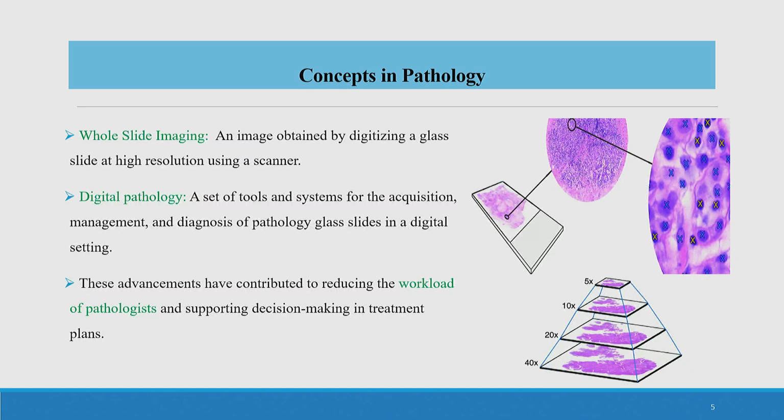Previously, this was not happening like that. The tissues were taken, but they were stored in paraffin blocks, and to manage and store the tissues was very challenging. But with the advent of new technology like whole slide imaging, it has been transferred, stored and organized with computers. So this technology provides some facility to apply AI techniques for the diagnosis of the cancer.